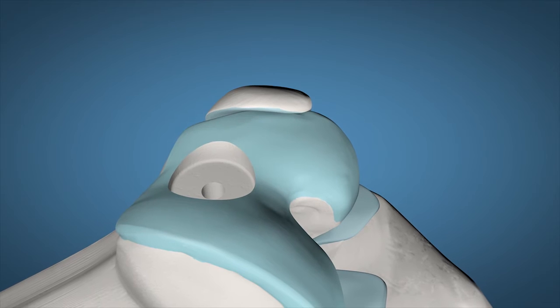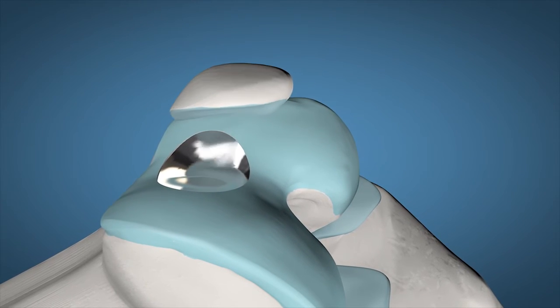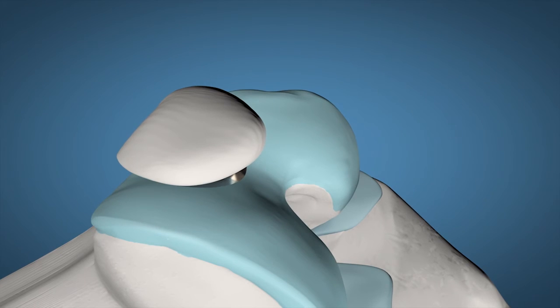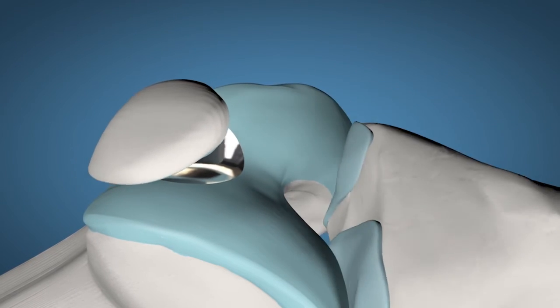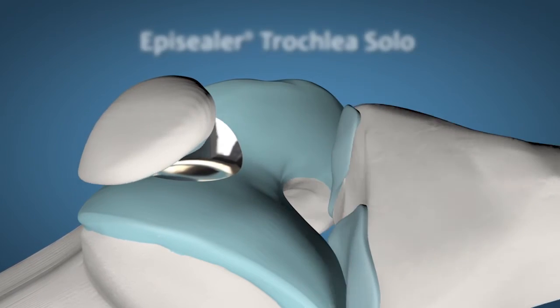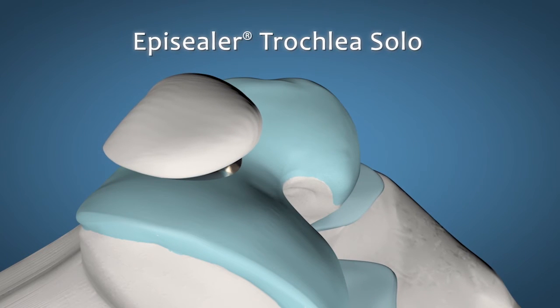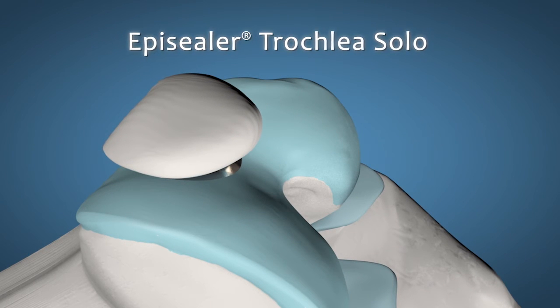The implant is now firmly inserted and sealed to the bone tissue beneath. The position and topography are perfect fits to the surrounding cartilage and provide an optimal surface for the patella to once again slide over the trochlear area.